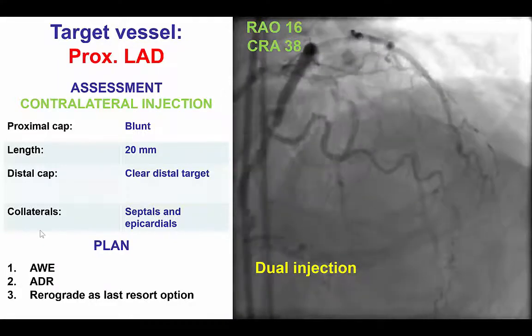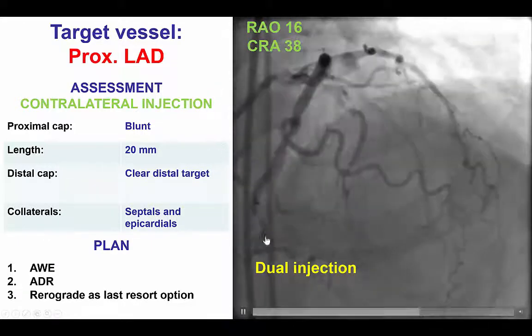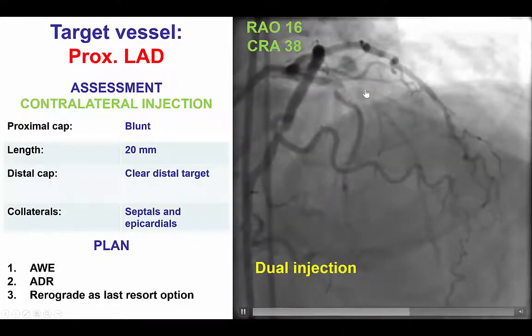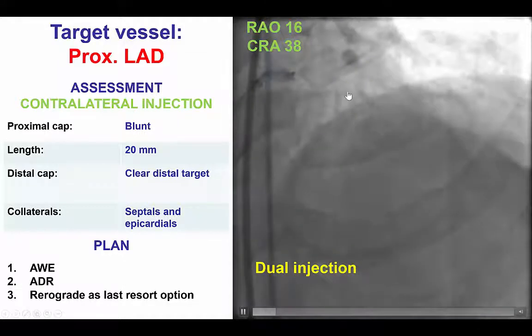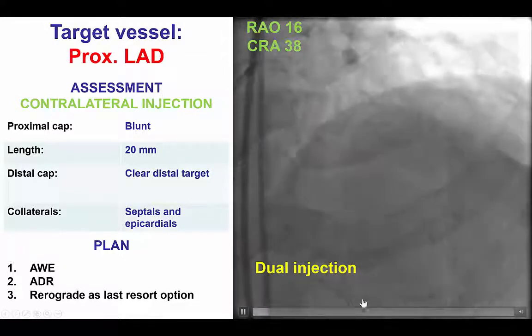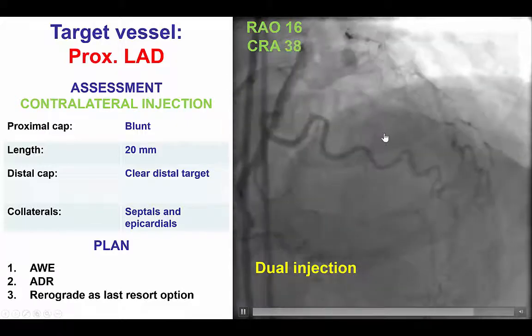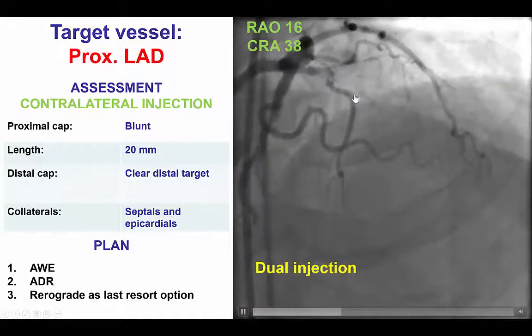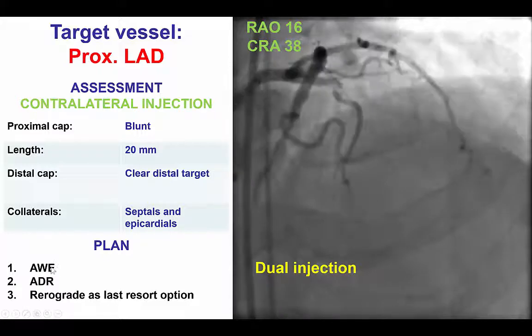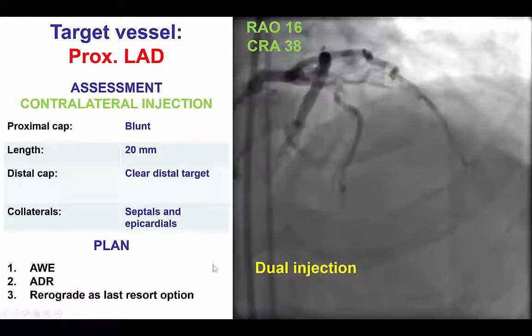We then decided to insert a second guide catheter despite the lack of collaterals in the previous angiogram, and sure enough, after we injected from the right coronary artery, there is now a nice filling of the LAD. We can see that there is actually a fairly short occlusion of about 20 mm, a good quality distal target, and both septal and epicardial collaterals supplying the mid-LAD. This transformed the case from a very challenging and risky procedure into a much simpler one, where antegrade wire escalation was the first approach, followed by antegrade to subintimal re-entry, with retrograde left as a last resort option.